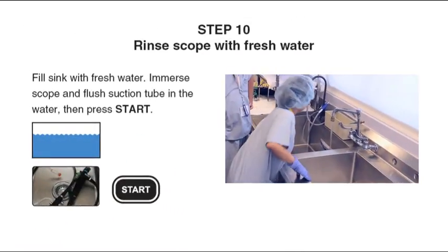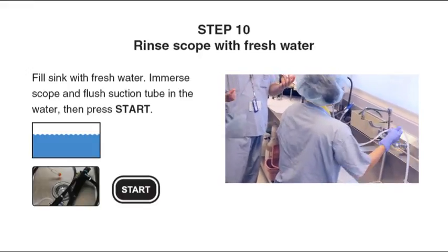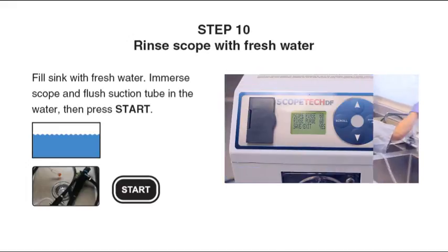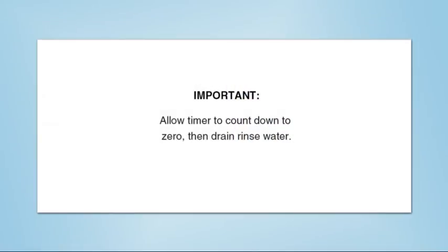Step 10: Fill the sink with fresh water. Immerse the scope and flush suction tube in the water, then press Start to rinse the scope. Allow the timer to count down to zero, then drain the rinse water.